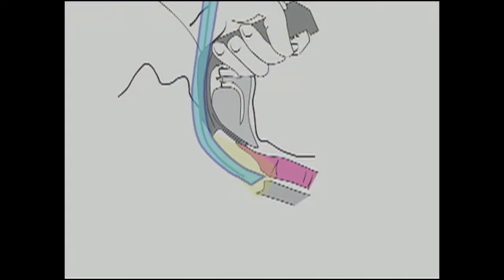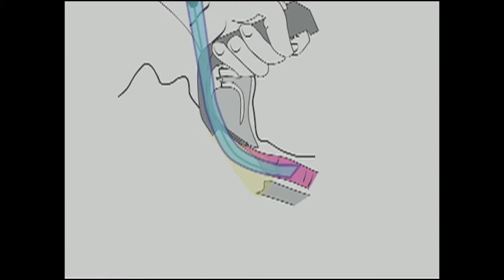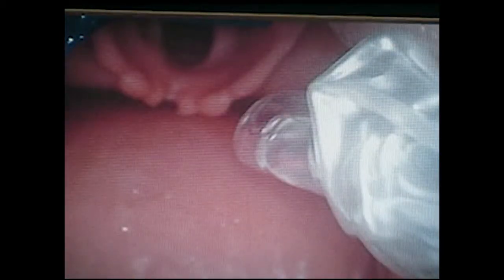You must leave enough room to be able to rotate your tip forward and upward into the larynx. If you keep bumping into the posterior arytenoids, pull the tube back until the tip is just visible, placing it higher in the pharynx. Now when you rotate forward again, the tip will be lined up with the larynx.